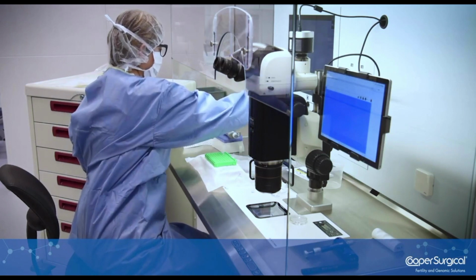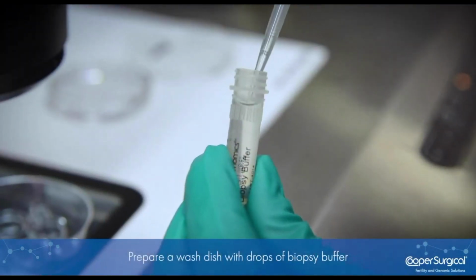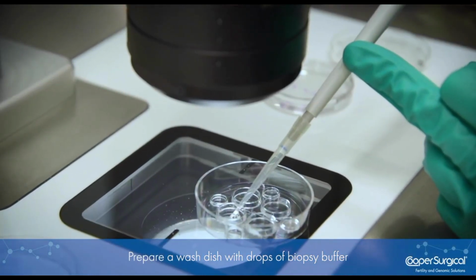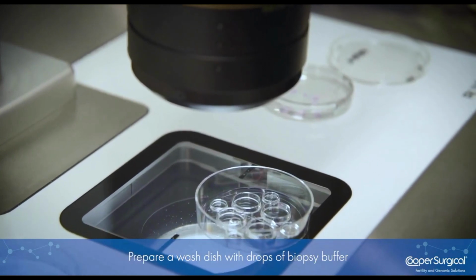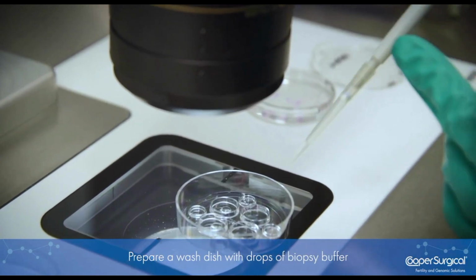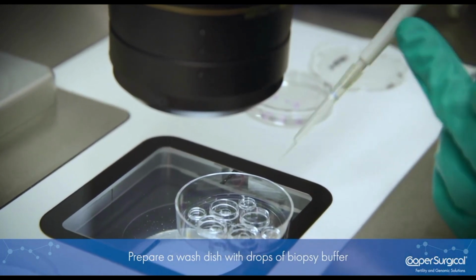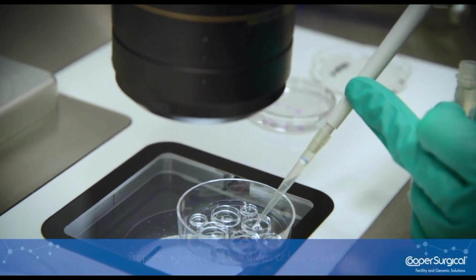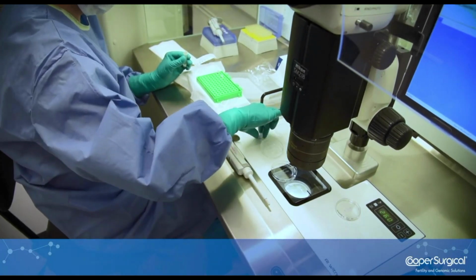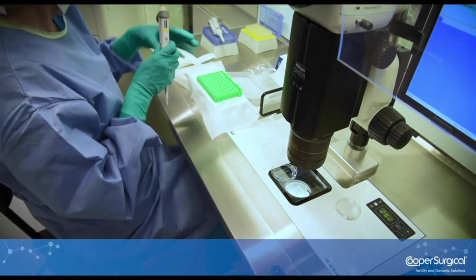When that is done, we will start preparing our washing dish. For this, we will record the name of the patient on that dish and the embryo number, and we will then add 20 microliters of the buffer in each of the wells. This is a unique dish for that specific embryo. So for each embryo, we make a fresh dish immediately prepared before we do the tubing.